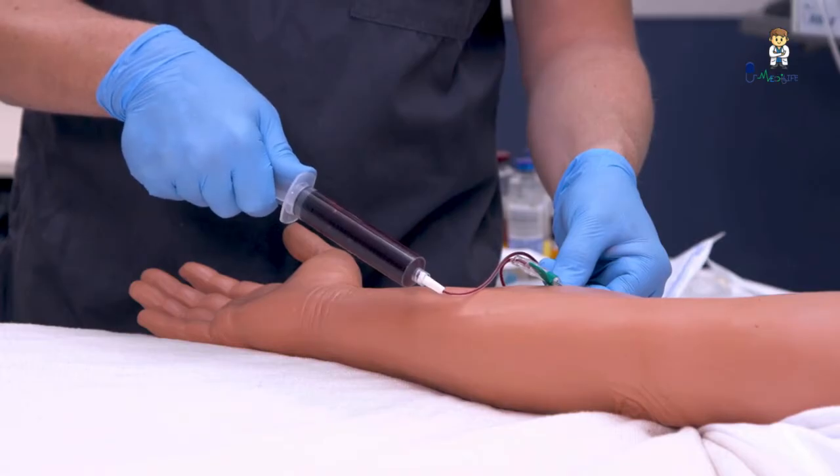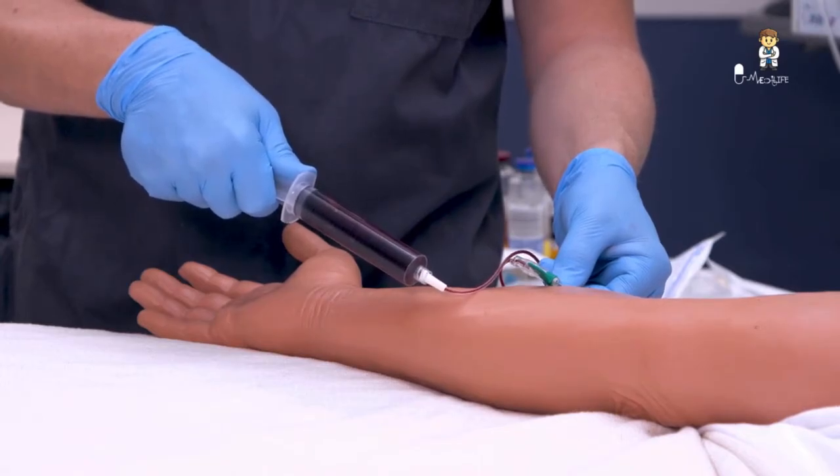Draw a quantity of blood sufficient for isolating organisms — 20 to 30 milliliters. Follow the manufacturer's recommendations for the blood sample volume required per collection bottle. Immediately release the tourniquet if used when blood begins to flow into the collection container.